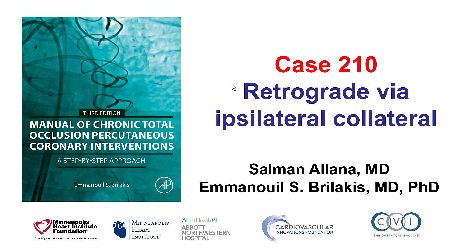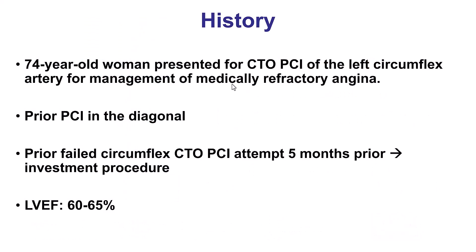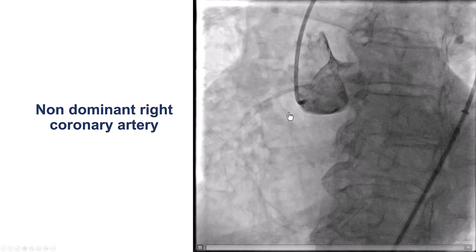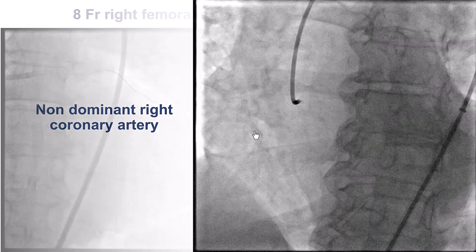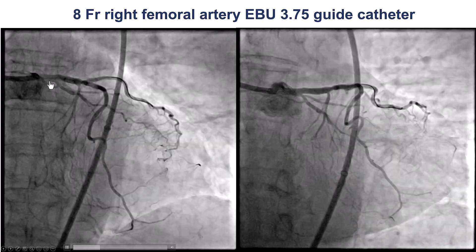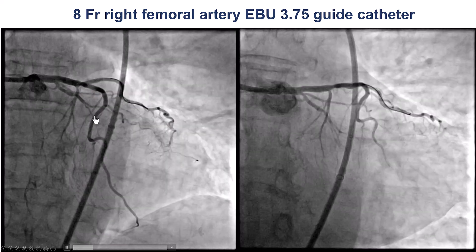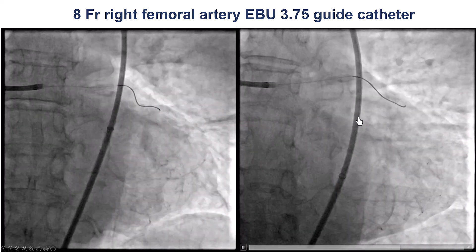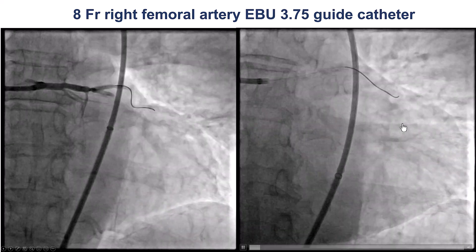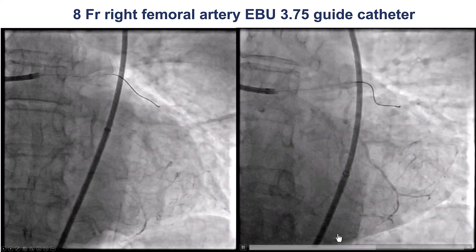This is a case of retrograde CTO crossing through an ipsilateral collateral. The patient was a woman who presented with medically refractory angina in the setting of a circumflex CTO with a prior unsuccessful attempt for re-canalization, and normal left ventricular systolic function. Coronary angiography shows a small non-dominant right coronary artery with a dominant circumflex that has a CTO in the mid-segment. The CTO has an ambiguous proximal cap, and there are collaterals from the LAD supplying the left PDA.